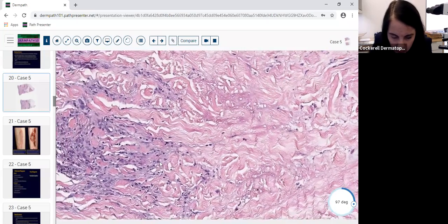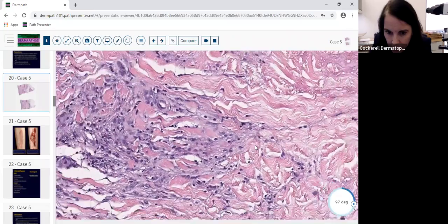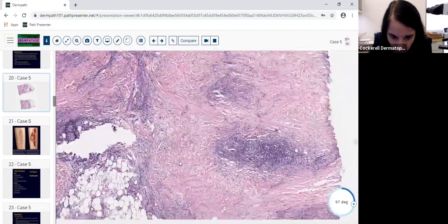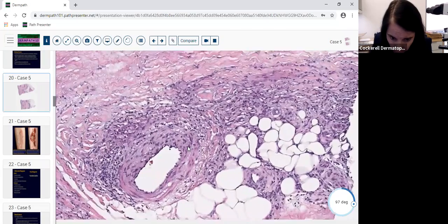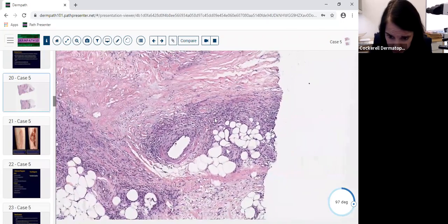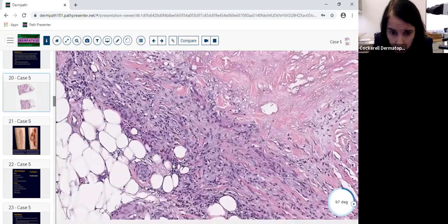The inflammatory cells are more epithelioid. You don't see the foamy cytoplasm that you see in xanthomatous processes that can mimic this. There weren't many giant cells here, but there is a feature that's extremely helpful. You'll sometimes find vascular changes in this process. For instance, there's some vascular changes here where you'll see some inflammation around the vessels. You often don't see frank vasculitis, either lymphocytic or other vasculitis, but at the interface here, you'll often see plasma cells, which is a very helpful clue.